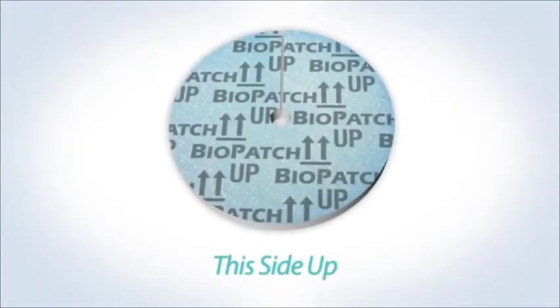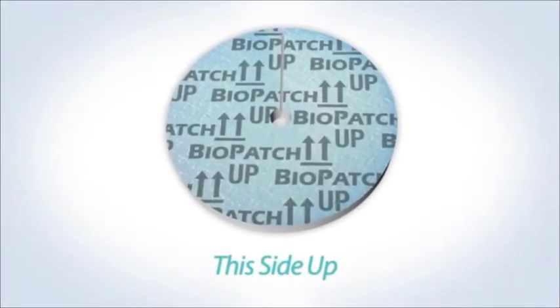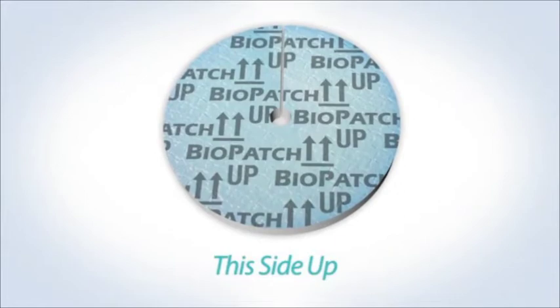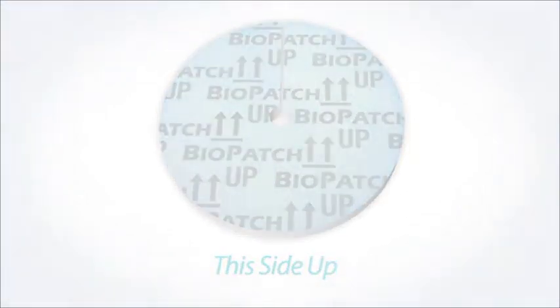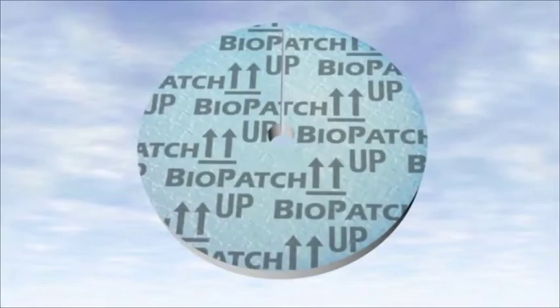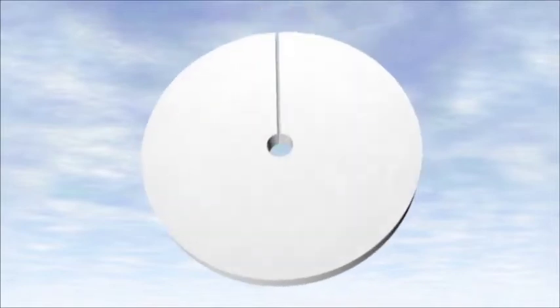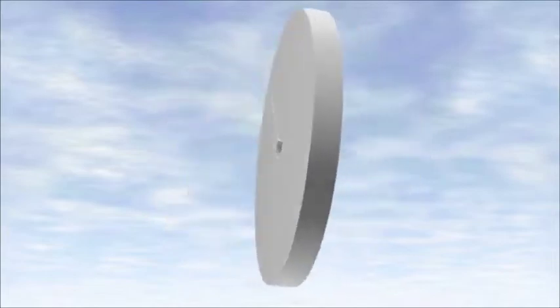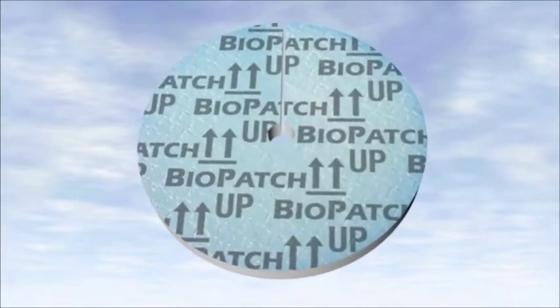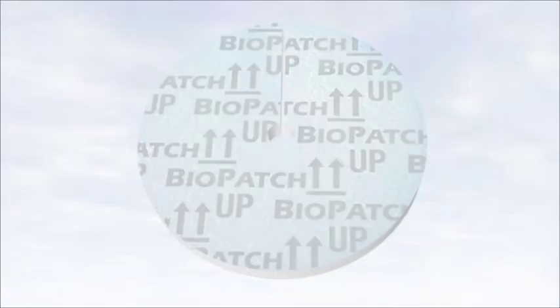Remove BioPatch protective disc from the sterile package using aseptic technique. The double arrow symbol printed on the blue side of BioPatch is an international symbol for this side up. Note that there are two distinct sides: a blue printed side which always faces up away from the skin, and the smooth white foam side must always be in direct contact with the skin surface. An easy way to remember this is printed side up.